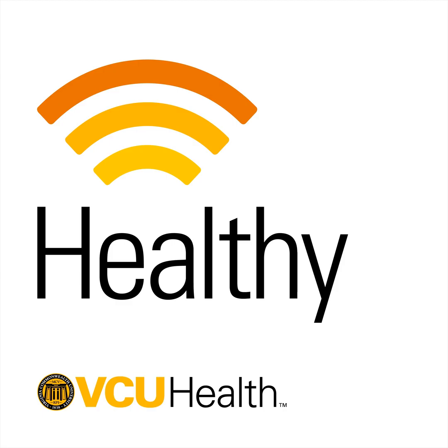Yep. And so it's that combination of the ability to check in with the patient in these small steps, make it a temporary lesion, and being able to get an MRI in real time showing us in the anatomy of the brain where we're delivering that energy that really is a major step over the old way of making a lesion. So the treatment lasts about 2 to 3 hours?